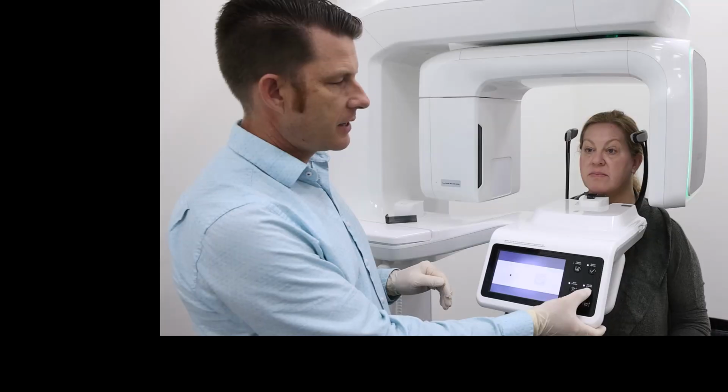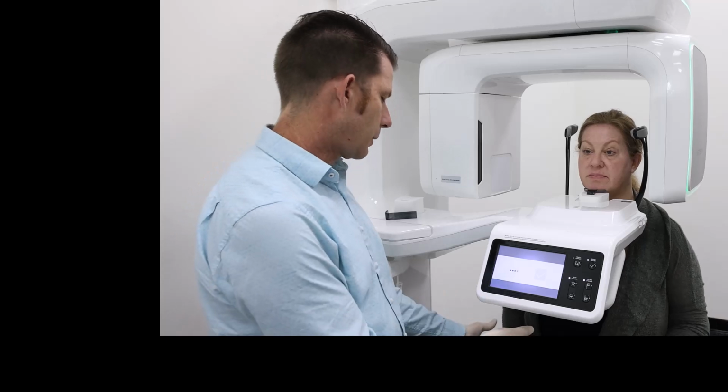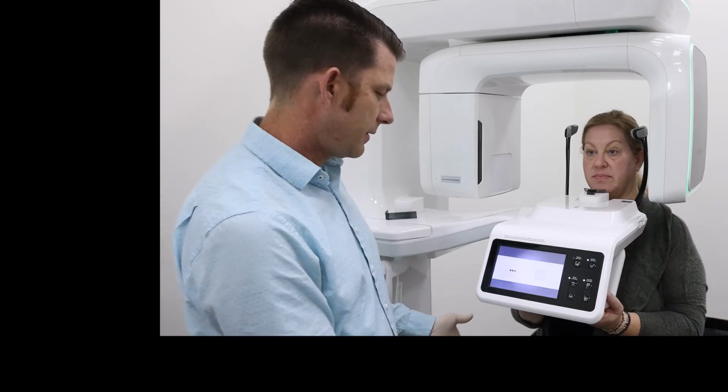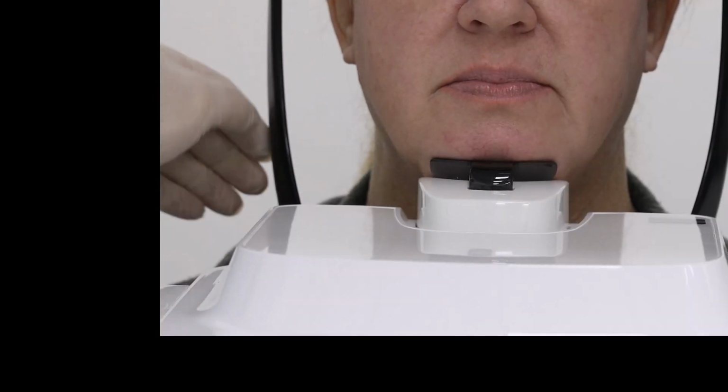I'm going to go ahead and raise the column up. We would go through our same positioning protocol. Go ahead and start with your hands, palms facing up, feet shoulder length apart, and put your chin on the chin rest. This short chin rest is utilized if we need to capture further superior into the sinus, thus lowering the patient down and raising the field of view up.